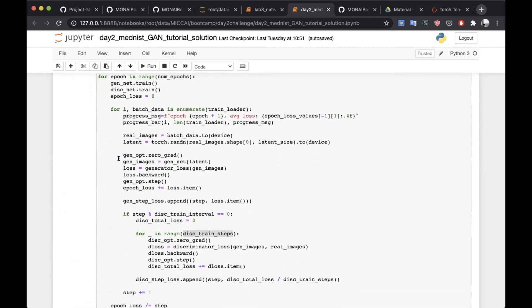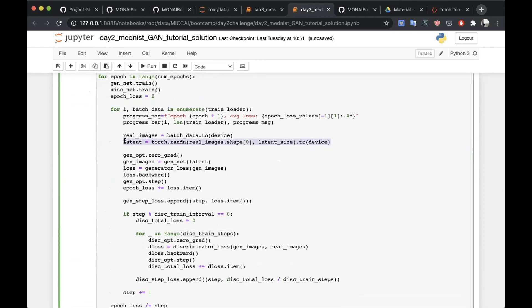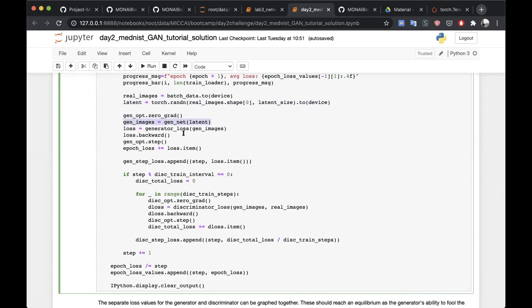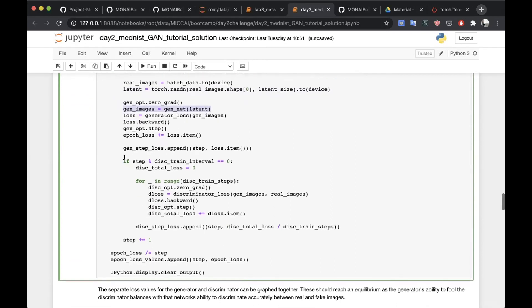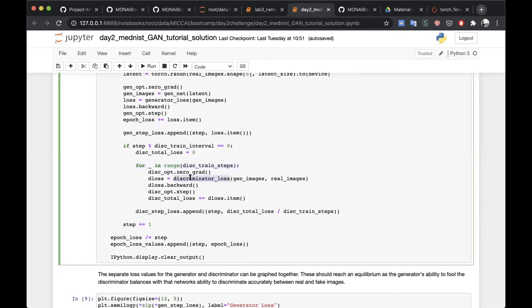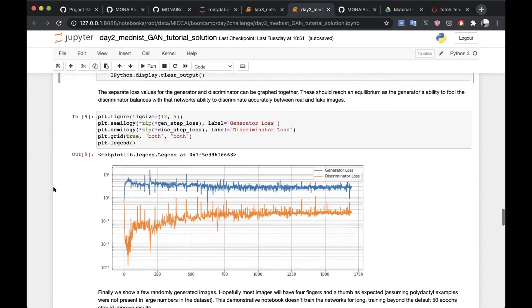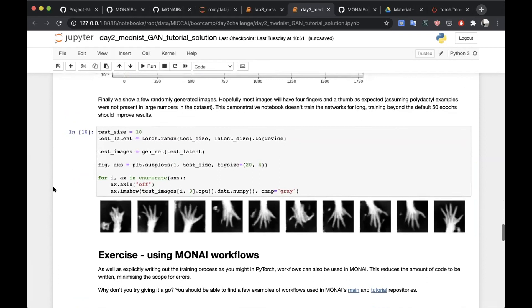On every iteration we step inside and run five loops where we calculate the discriminator loss. Then we set it to run and print the output. Once we've trained it and we're happy with the network, we can create more random latent tensors, use those to generate test images, and display them. They look like something out of a horror film — there is a comment saying that if you manage to increase the number of epochs, you'd end up with nicer images.